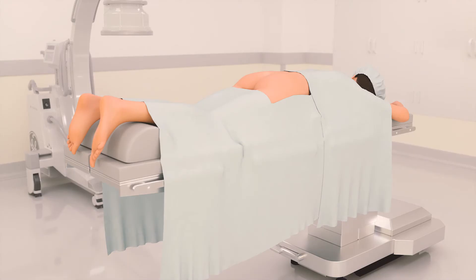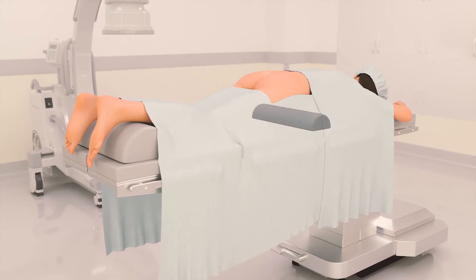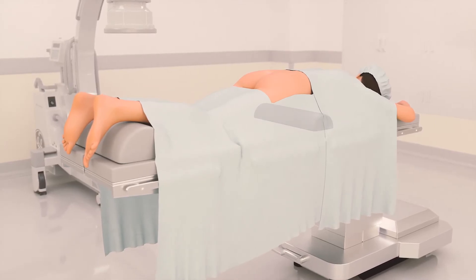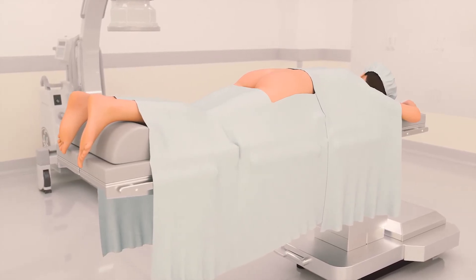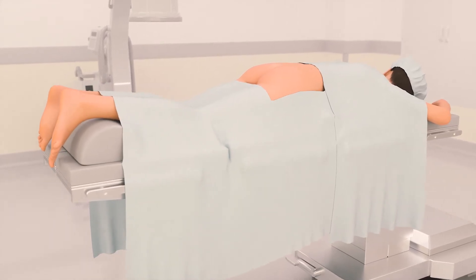The patient is positioned so that they are lying prone with elevation provided under the hips to allow for a flattening of the sacrum. There should not be any rotation or tilting of the sacral area to optimize for ideal imaging and ease of needle placement.